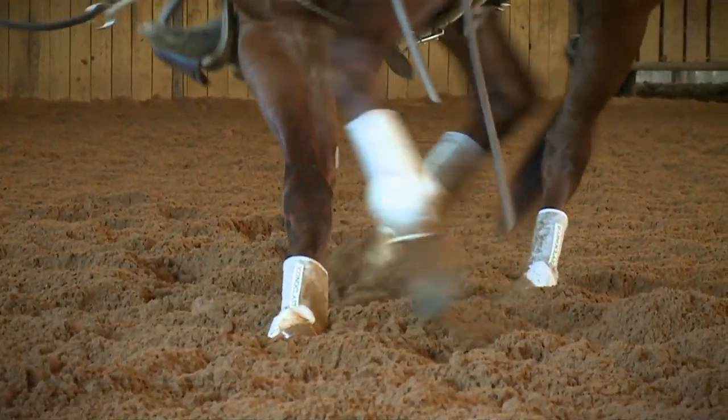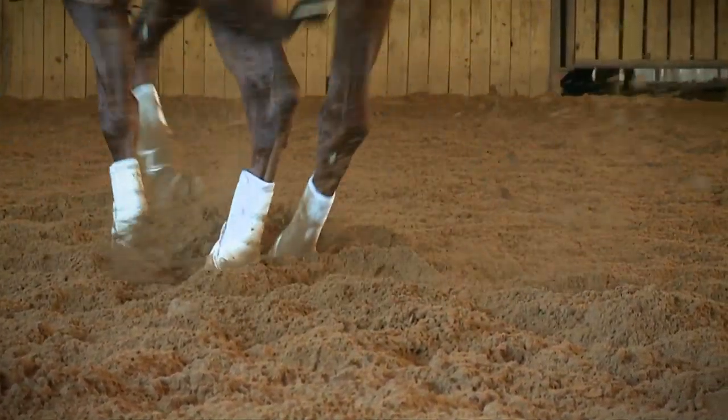My name is Ward Hyde. I'm the inventor of the Iconoclast equine support boot. Today, I'd like to help you understand the function of the Iconoclast boot, why we developed it, and what its actual purpose is: providing beneficial support and protection to the equine leg.